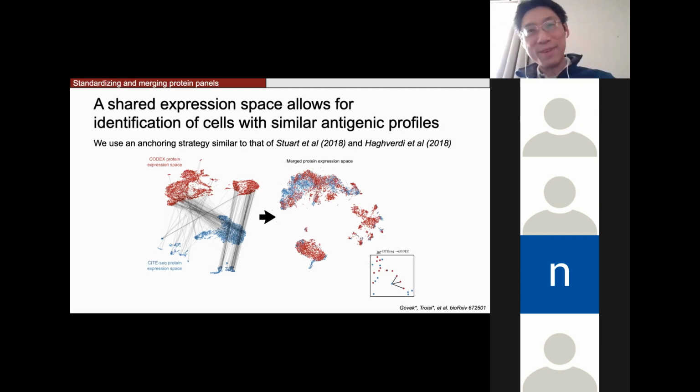If you cut the entire spleen into a bunch of tissue sections, but your spatial data comes from only one of those many sections, then I think the difference you see here, for example between the red and blue, is probably real. That tells you which cells you are missing in that tissue section.